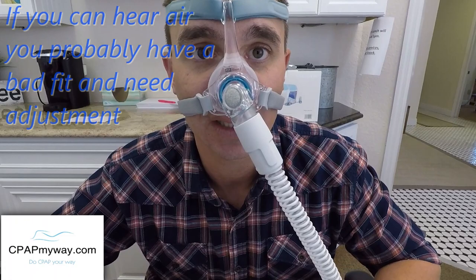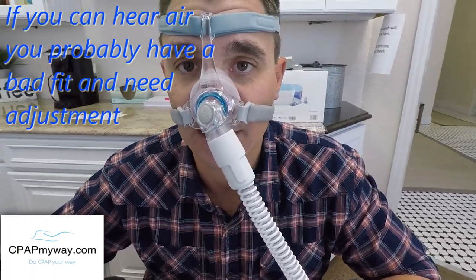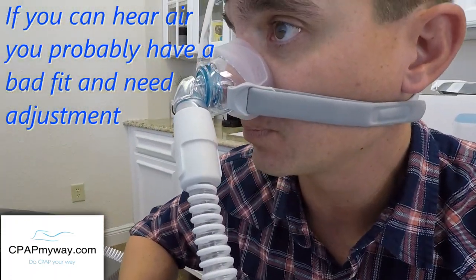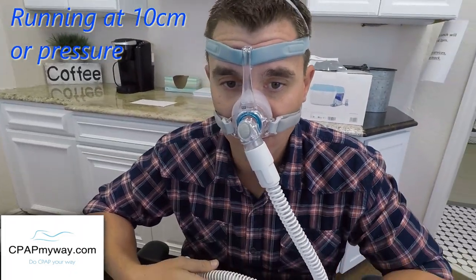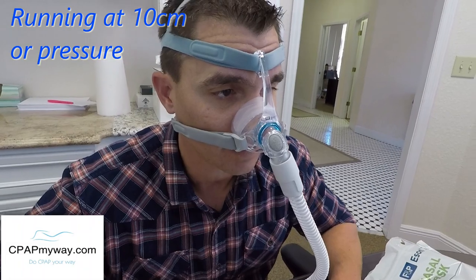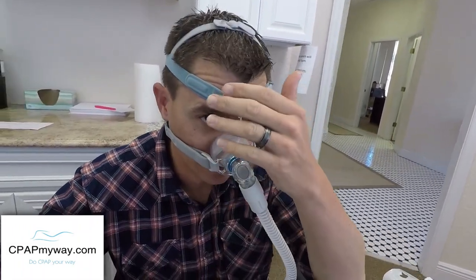This is that little quick connect I talked about. I'm going to turn it on. It's on a setting of 10 centimeters, so pretty significant setting there. You really just can't hear anything, and I'll tell you honestly, I'm up against it, you can't hear any of that exhalation coming out of that diffuser.